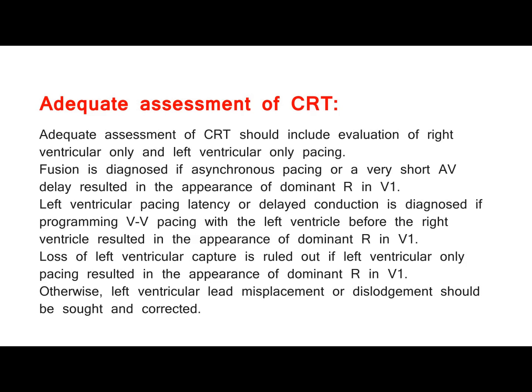Loss of left ventricular capture is ruled out if left ventricular only pacing resulted in the appearance of dominant R in V1. Otherwise, left ventricular lead misplacement or dislodgement should be sought and corrected.